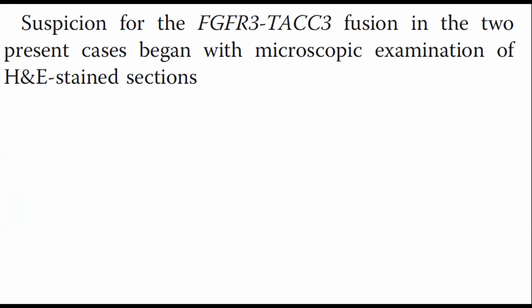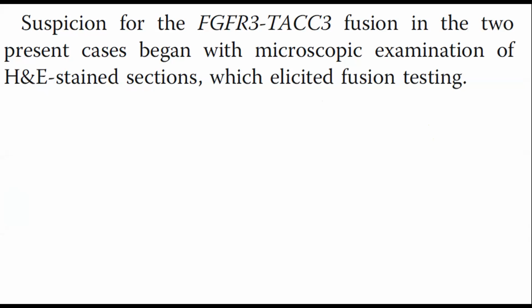Okay, I just want to read some quotes from this paper. I really enjoyed this paper, putting it together. And what it shows is the power of old-fashioned H&E, the power of H&E. It is phenomenal. "Suspicion for the FGFR3 TACC3 fusion in the 2 present cases began with microscopic examination of H&E stained sections, which elicited fusion testing."